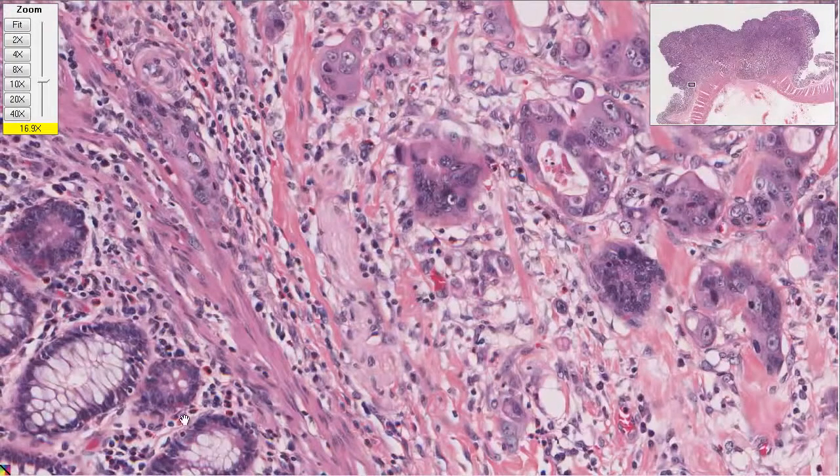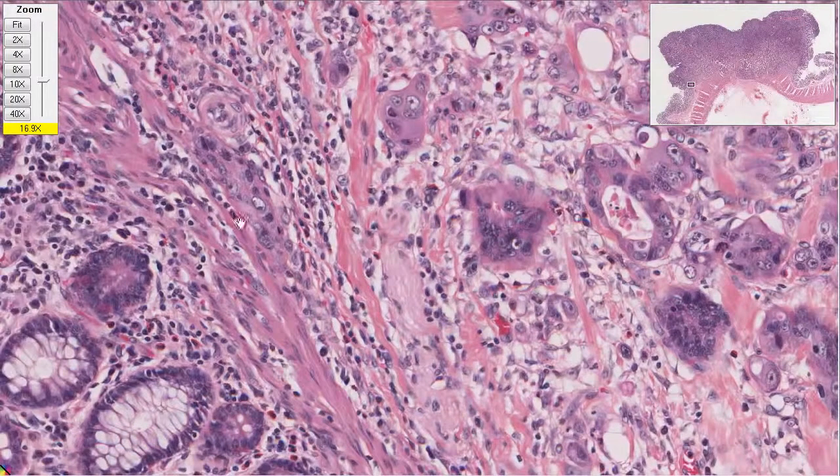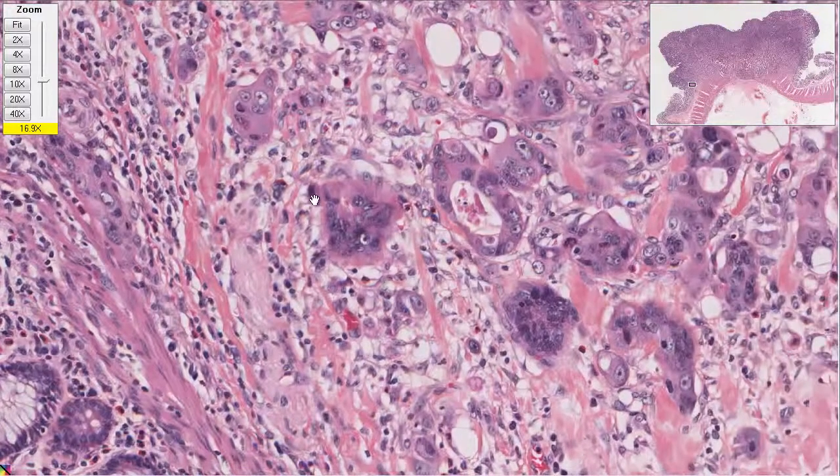And so these are the normal ones. They're doing their job, making the mucin, nuclei at the bottom. What is this guy doing? It's just chaos. Before we talked about carcinoma in situ, a cancer in the spot. If you saw cells this bad, you'd say, do not let them go far, because they will have a tendency to invade. They're crazy. This right here is a bunch of the cells. You can see they're really haphazard. They're growing. They're not doing their job.